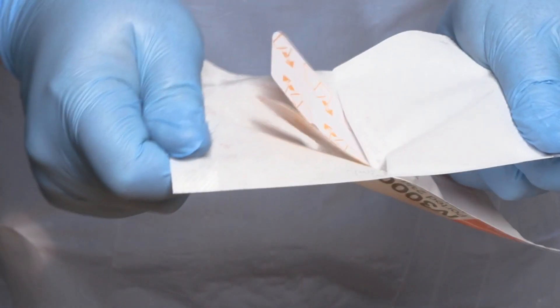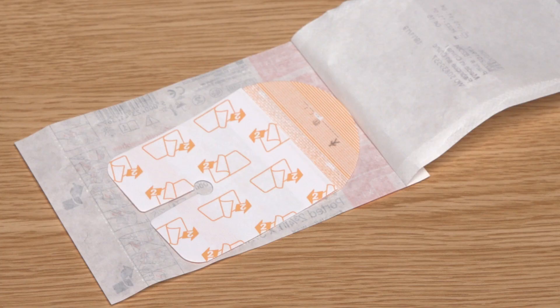I'm going to use an aseptic non-touch technique to peel open the dressing packet. You will see that I'm using the dressing packet as a microcritical aseptic field to protect my dressing from contamination until I'm ready to use it.